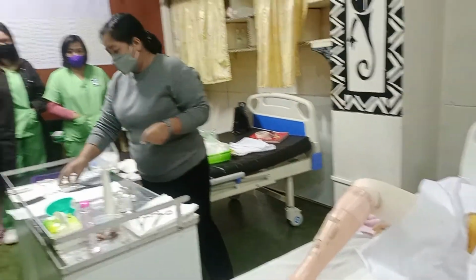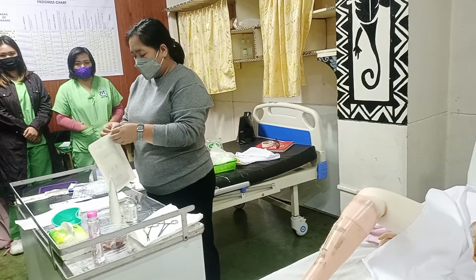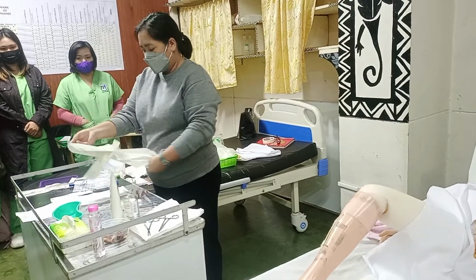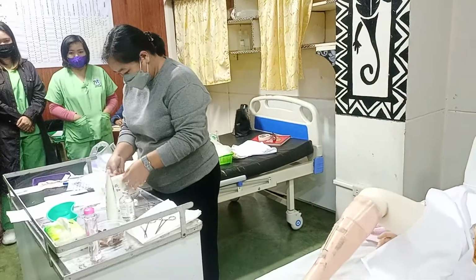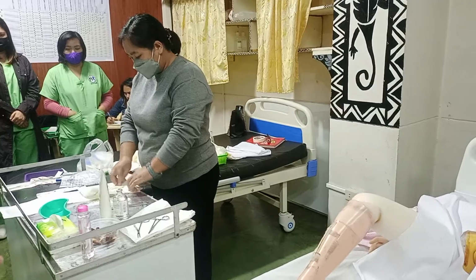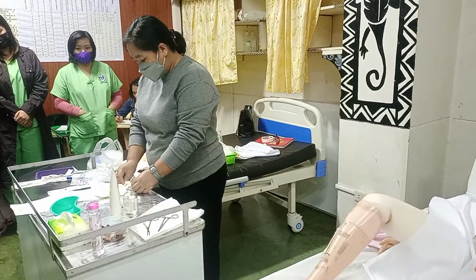Since okay na si ma'am, check nyo pag kailangan mag-perineal area, ay mag-perineal care. Okay. Open it. Yung mga nasa gilid, yun yung dapat ninyong hawakan if you're going to open.